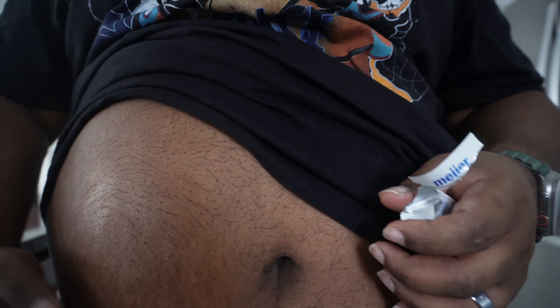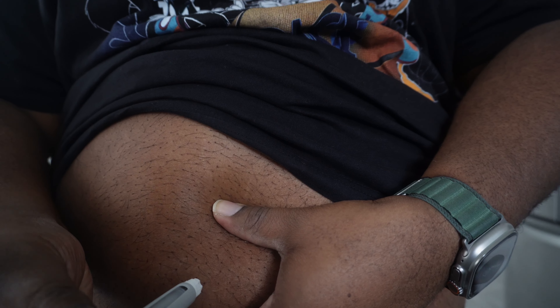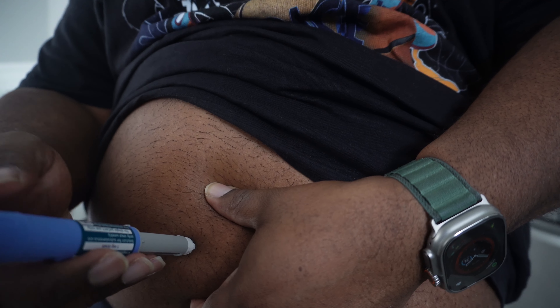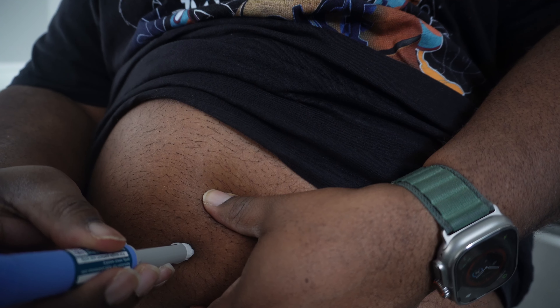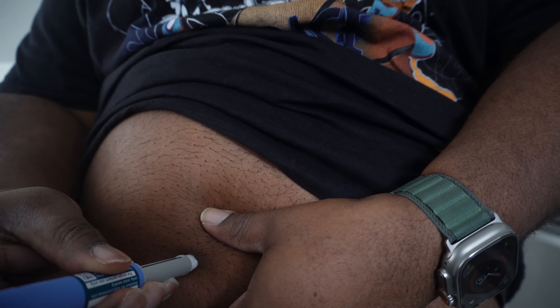I'm just going to clean the area right here and allow that to dry for a few seconds. Then I'll grab my stomach, pierce the skin with the needle, press and hold — I like to count to 15. The recommended time is about six seconds, but I always wait to count to 15 to make sure everything has been injected. Now that that's done, I'm disposing of the needle — putting the cap back on, placing the other cap on, rotating off the needle, capping the pen, and putting it back in the packaging to go in the fridge.